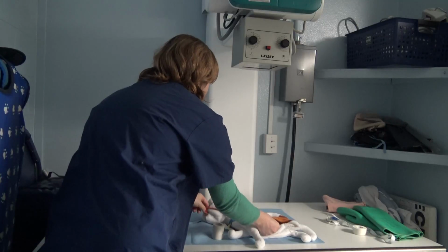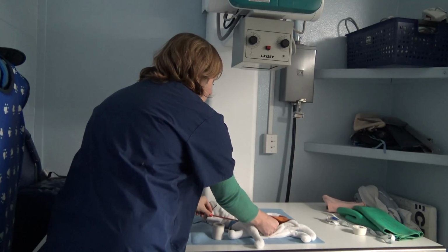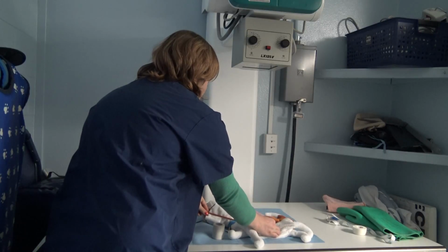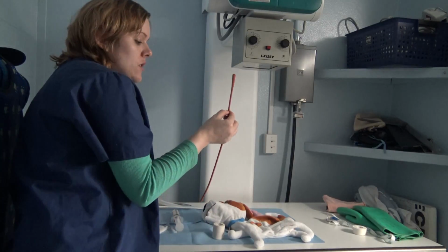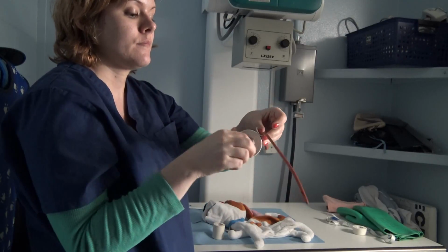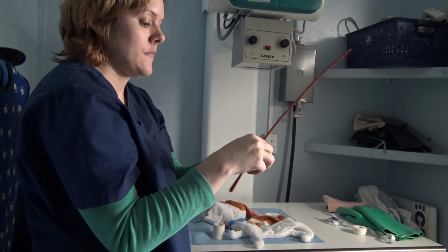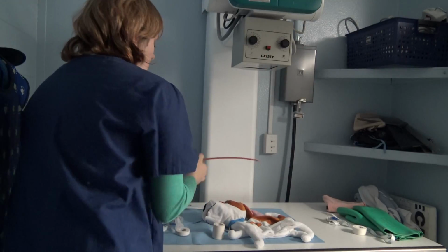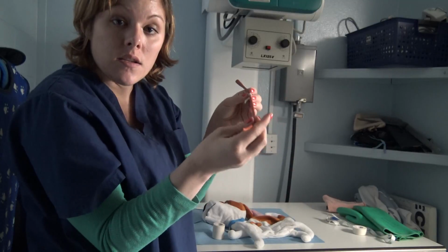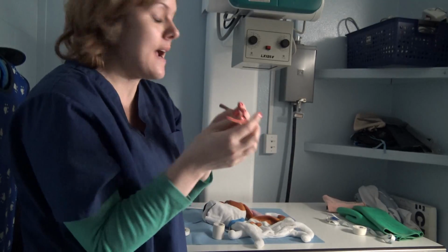So the end of the rib cage. And what I'm going to do is tape on my stomach tube to ensure we'll have the right length to make sure that it's in the right placement in the abdomen.